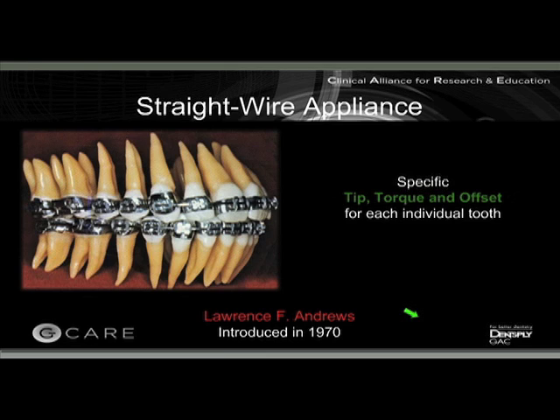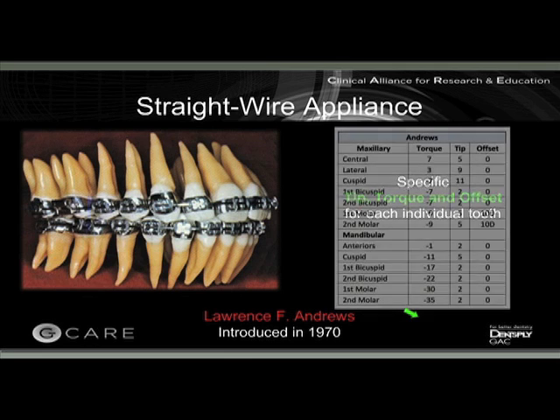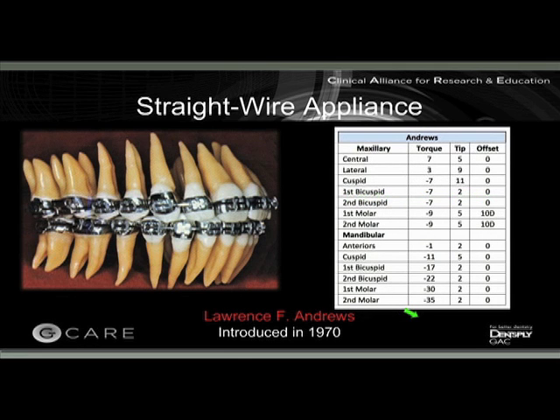I have to give a little bit of an introduction of the history of the straight wire so we understand what we have now, why we modify some of the things that we're using. And I think it's important to emphasize that the straight wire was developed in 1970 by Larry Andrews. It was the first tooth-specific appliance that has tip, torque and offset for each individual tooth. And that was basically when the prescriptions started becoming popular.